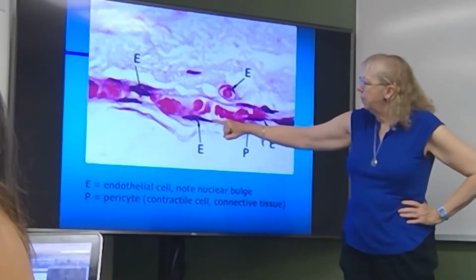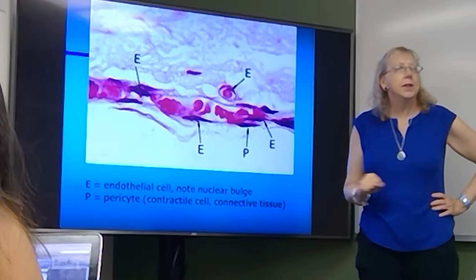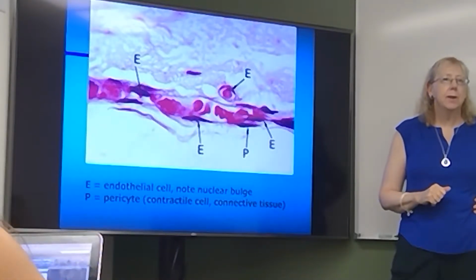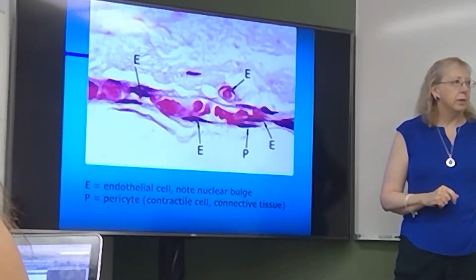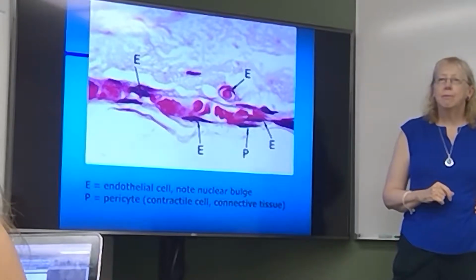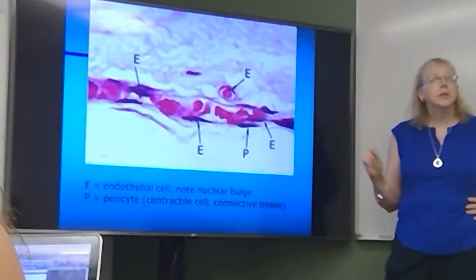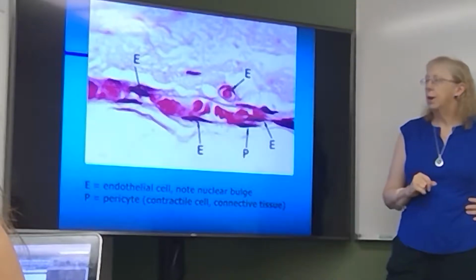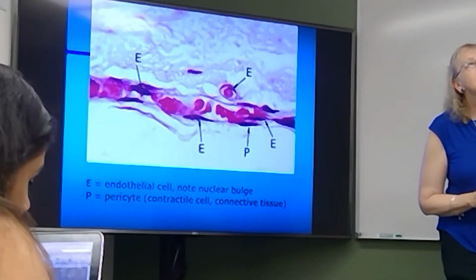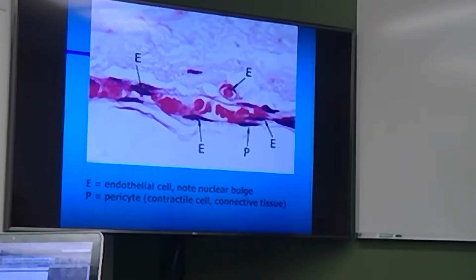And then you can see that the cytoplasm extending out along here in the squamous cells stains pink. And the pink is stained by the dye called eosin that binds to protein, positively charged substances. Eosin, E-O-S-I-N. And it dyes pink. So it's pink, it's staining proteins. And hematoxylin stains the nuclei in the tissues. This is what is referred to as a routine stain.